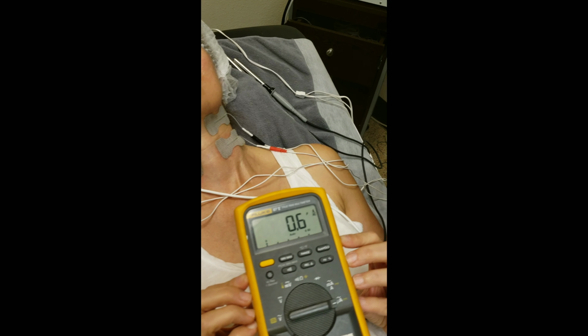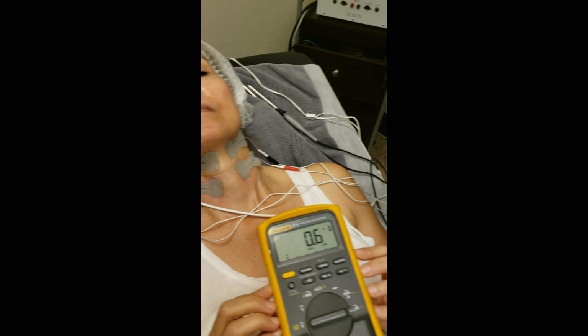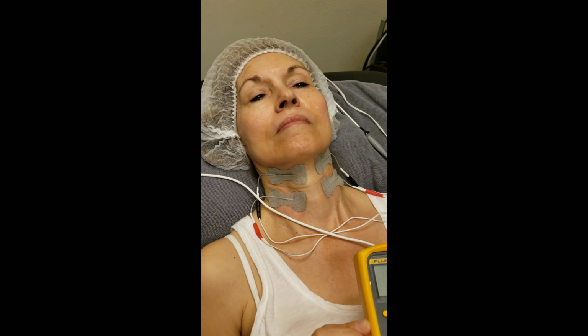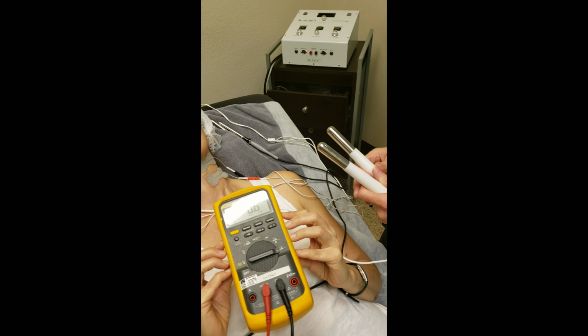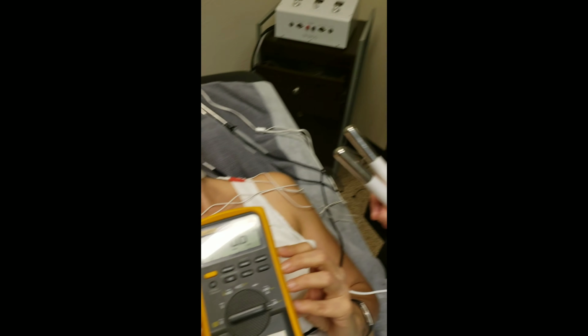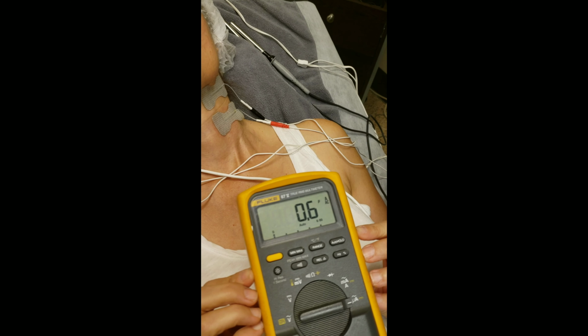As you can see, of course, we don't have a load on the probes. We do have the load on the face pads, but we're measuring from the probe because our concern is to see, while we're connecting the face pads to the skin, how much current is going to be delivered to the skin via the probes. So right now the probes are not touching the skin, so there's no current flowing, so we're virtually at zero.